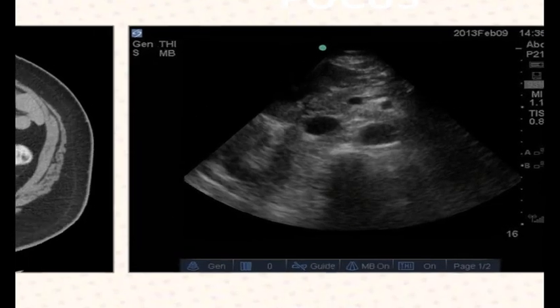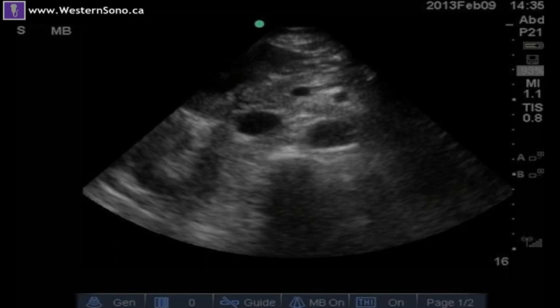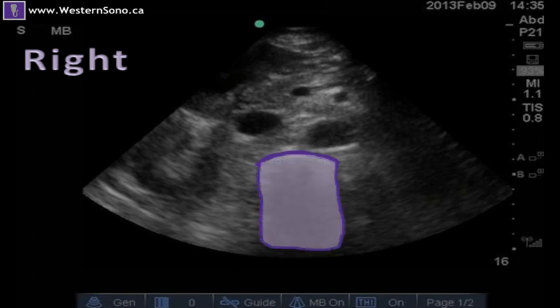Turning our attention to the ultrasound image, we will again see that the orientation of this image is in the same plane as the CT scan, and in point-of-care ultrasound lingo, this is a transverse scan of the abdomen. By convention, our probe marker will be shown on screen left and represents the patient's right. Here we can again identify the vertebral body, although in this instance it's characterized by a curvilinear echogenic line and an acoustic shadow immediately in its far field. This is our sonographic landmark for the study.